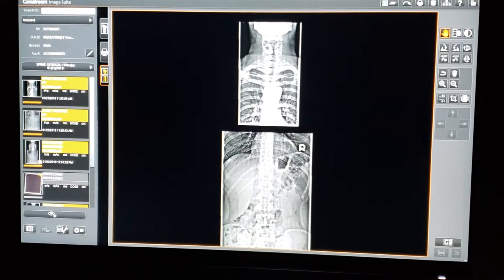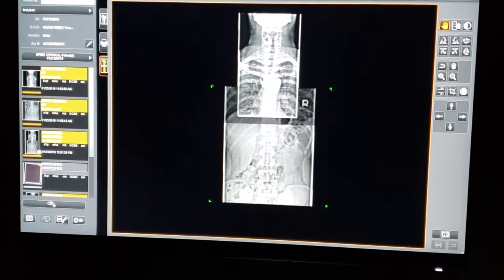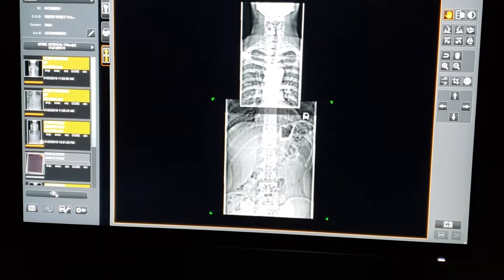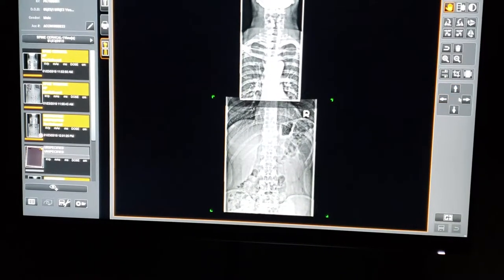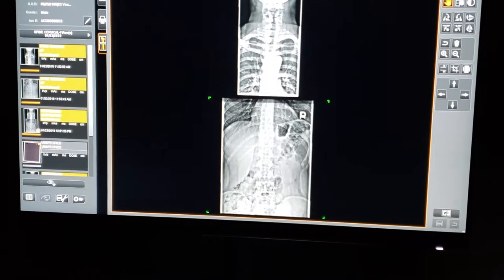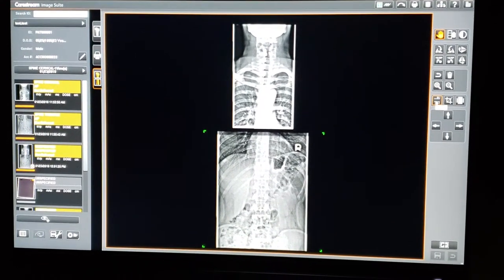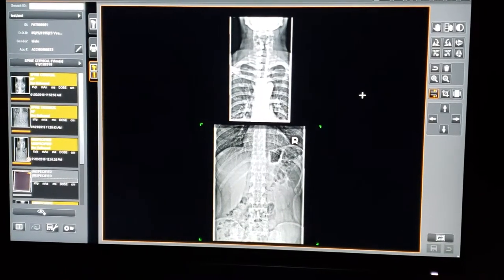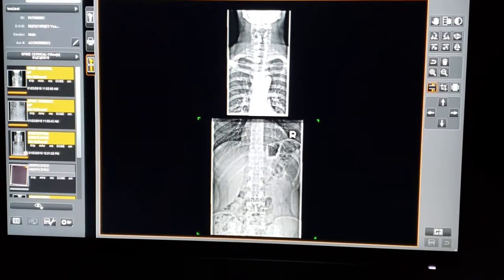There are a couple of different ways of doing it. Left-click and hold on each image and you can position them manually. You can also use the up and down arrows on the right-hand side, or you can use the fiducial tool right here.